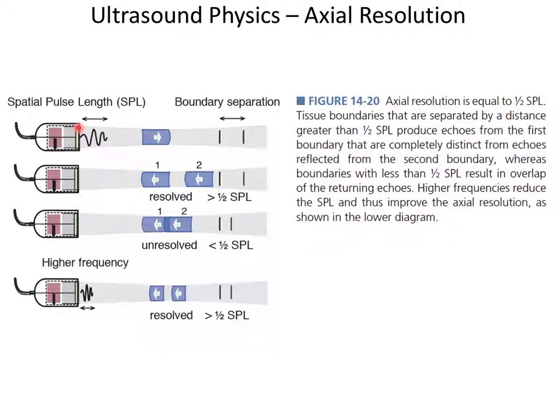Because the signal goes out, hits this one, starts to reflect, hits this one, starts to reflect, and you get a mixture of the two chirps, right? And so now we've got a summation of those two chirps, and it's going to come back, and whether or not your electronics can figure out that it's two separate things or one is in doubt because they're too close. And so basically your resolution is determined by the width of this ping.